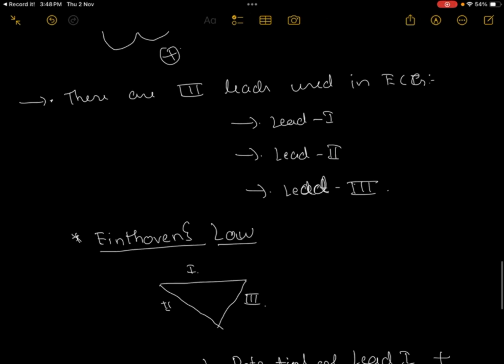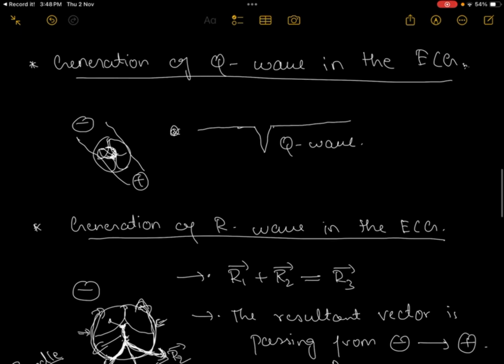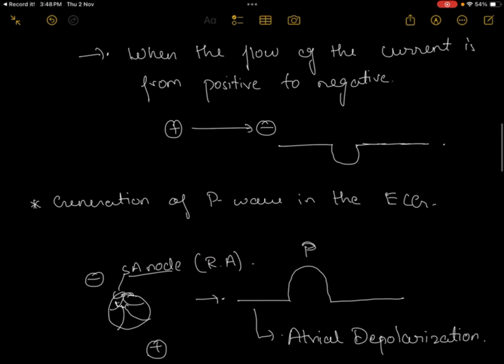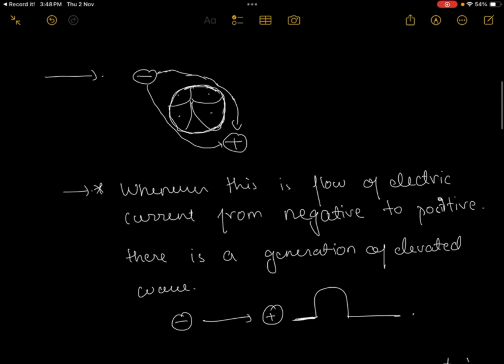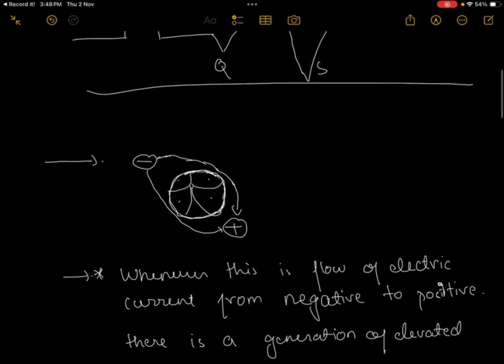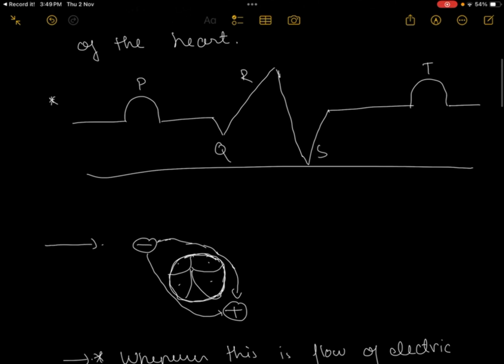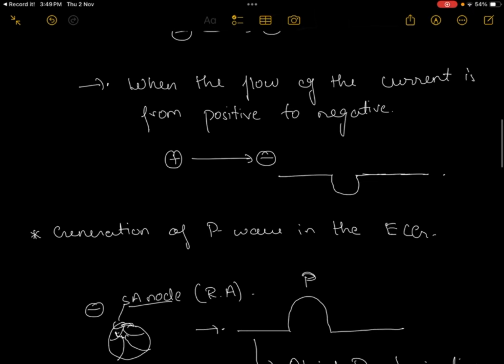There are a lot more topics to be discussed about ECG, about the leads, and about the augmented limb leads and how they are used to interpret the ECG pattern, which helps in the diagnosis of a patient suffering from any cardiac disease. I hope you got this topic.